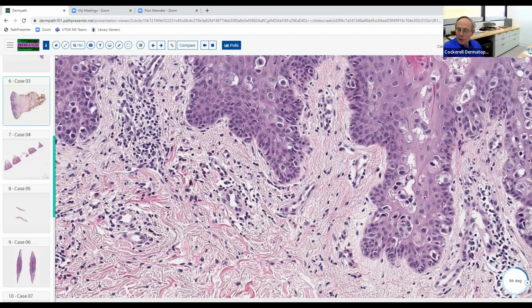This is an epithelial mucin, so it's more analogous to the type of mucin that's produced by your salivary glands or your nose when you get a cold, that sort of thing. So that's what we call epithelial mucin, or sialomucin. It's a little different chemical structure than hyaluronic acid, which is the mucin that's produced, let's say, in a focal cutaneous mucinosis, or the mucin that you see in granuloma annulare or something like that, pretibial myxedema.